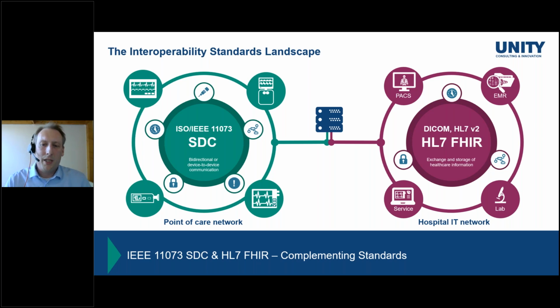So for an increasing number of use cases, especially those that I described at the beginning, the red ecosystem is where we need the data from. Also, laboratory data needs to get back into the green circle so that we can make use of it. Of course, also something like patient demographics. On the green side, we need some kind of way to exchange the data between these two circles.